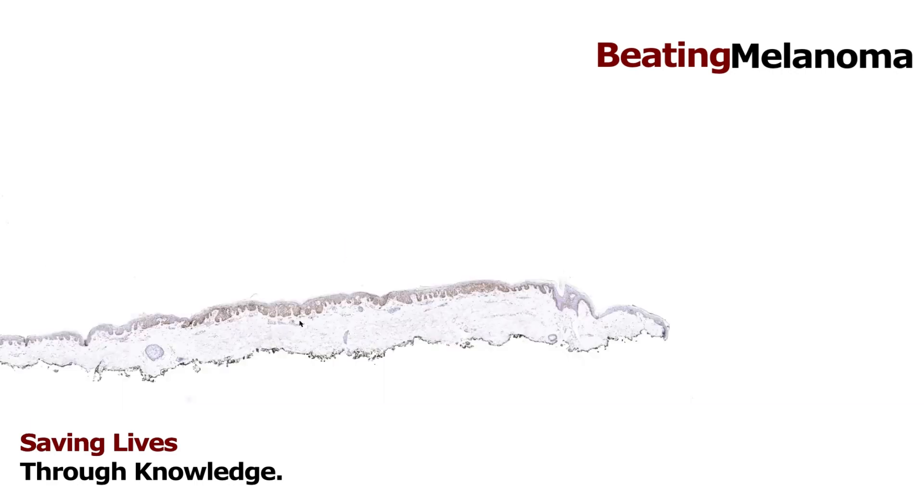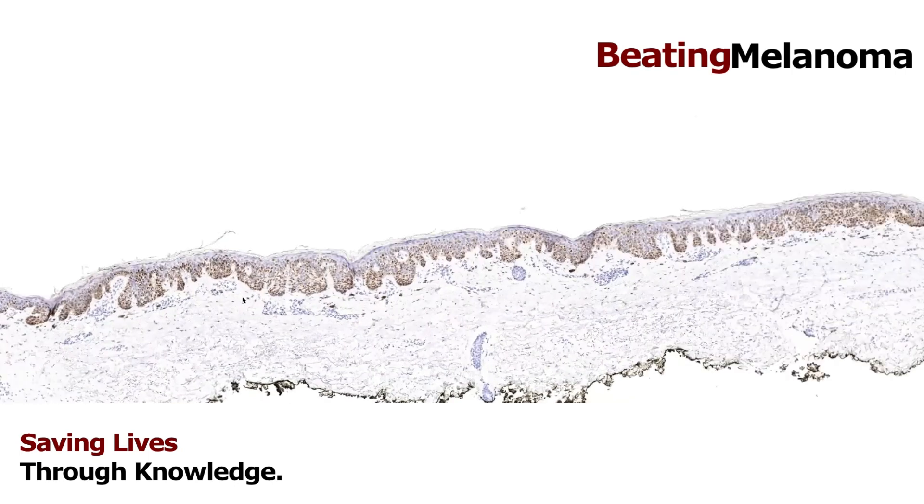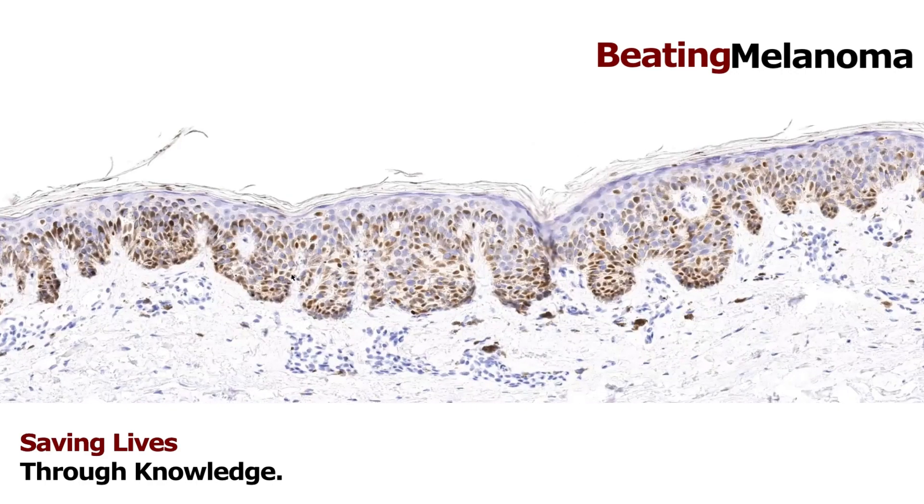Before we shift to invasive melanoma, I wanted to show one more thing: PRAME. PRAME is a marker that's come out in the past five to seven years. It's a marker that is often positive in melanoma cells and often negative in benign melanocytes or benign nevi. No stain is perfect or 100% — stains are a useful tool that help pathologists, but they're not a magic marker that solves all our problems. We're always looking for the perfect stain to tell us 'cancer or not cancer' — in skin pathology and all areas of pathology — but unfortunately there is always nuance.